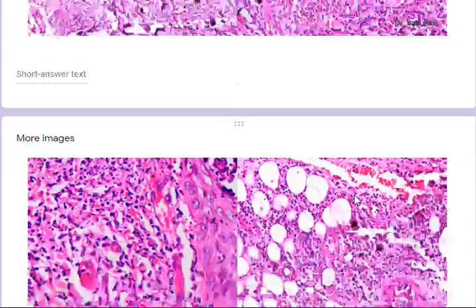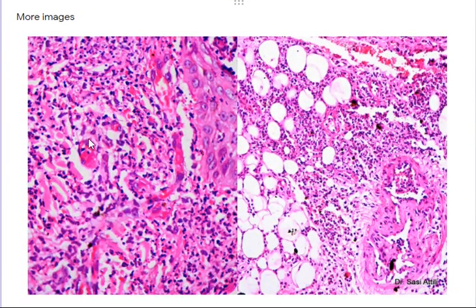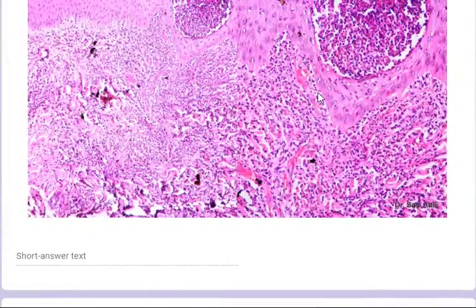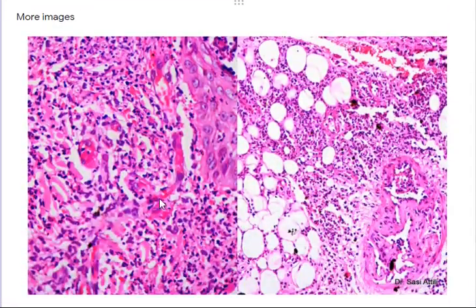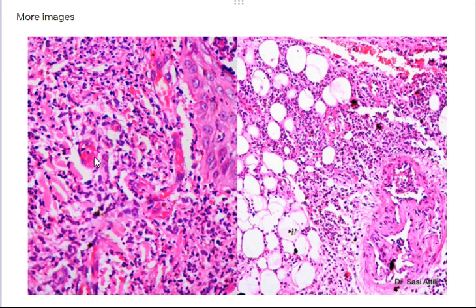At higher power you can see fibrin within the small vessel wall, still in the papillary dermis, with extravasated RBCs visible here. This is essentially a close-up of the dermo-epidermal junction area. In this region you can see fibrinoid necrosis of the vessel wall — this is a very small vessel — with thrombus and fibrin that are difficult to differentiate when there is such intense inflammation.